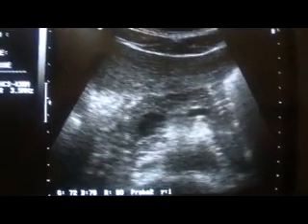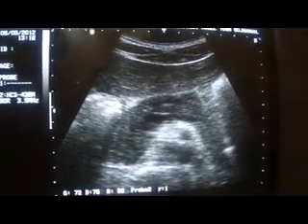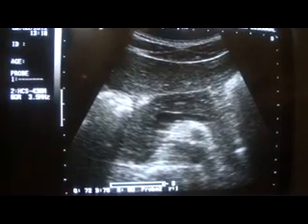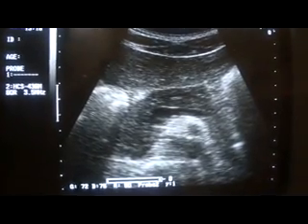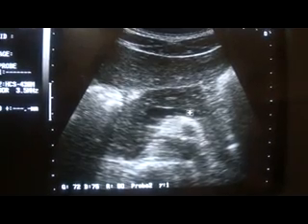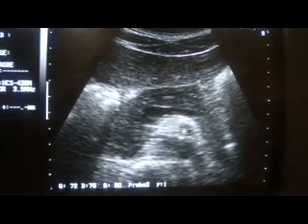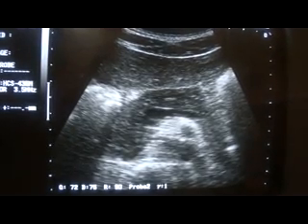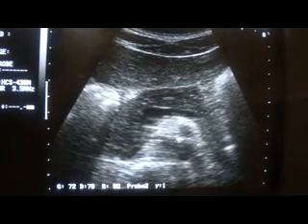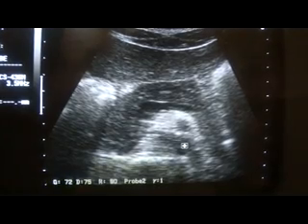So let's see what is happening when I place the probe in the subcostal region and give a slight pressure as well. This is the aorta in longitudinal section.